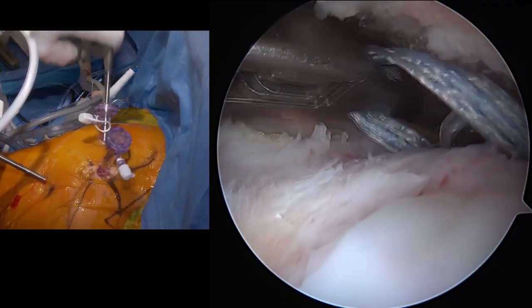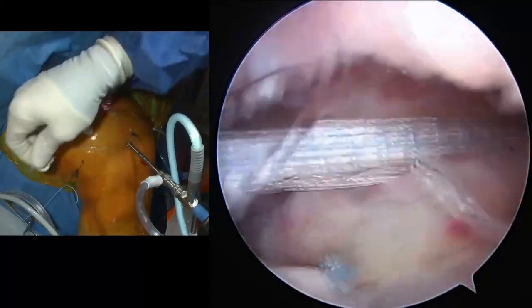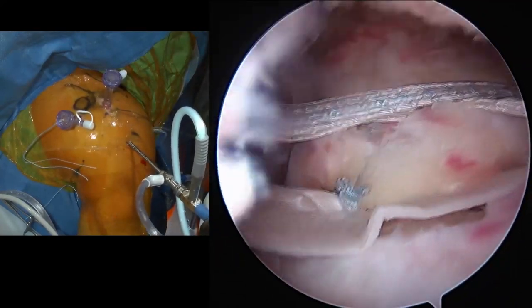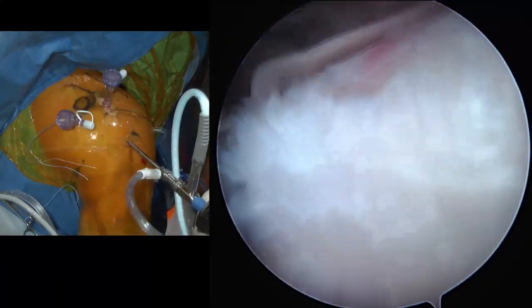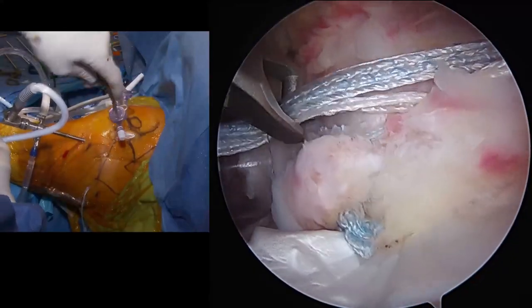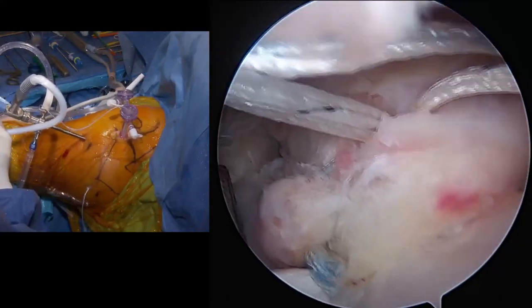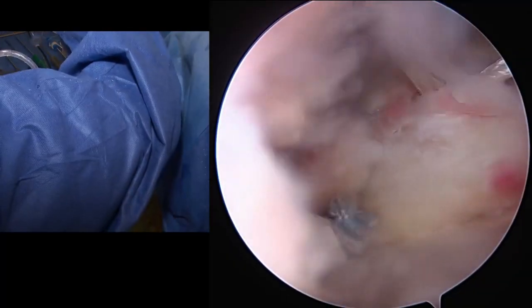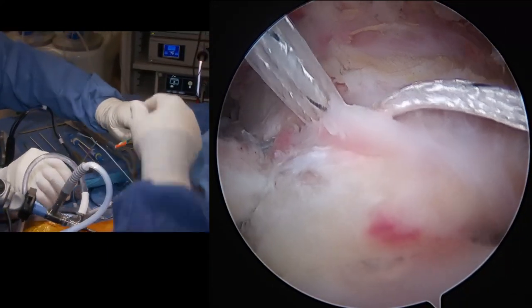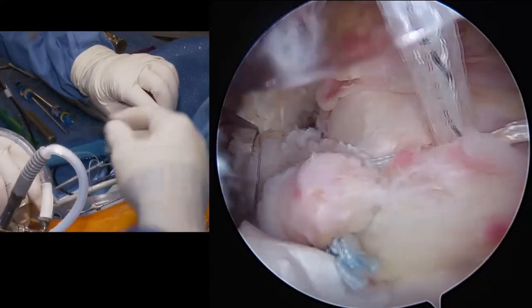So this will be our front anchor. And since that's pretty much ready to go, let's just see if we can pull those guys here. And we kind of know where that needs to go off this edge here. So let's go ahead and have our fiber tape retriever one more time. I think this will be a much better angle. Yep, and we'll come through here. And let's go ahead and load up our anchor. Can we load up our anchor? Good, and then pull that. And I'll put a hemostat on that end. Thank you, and then just set that down.